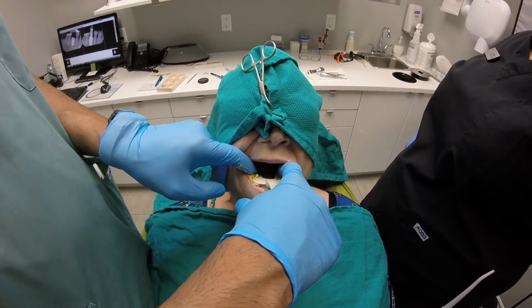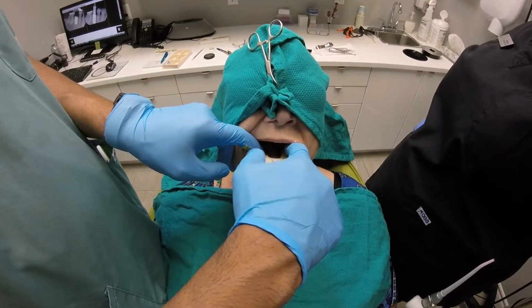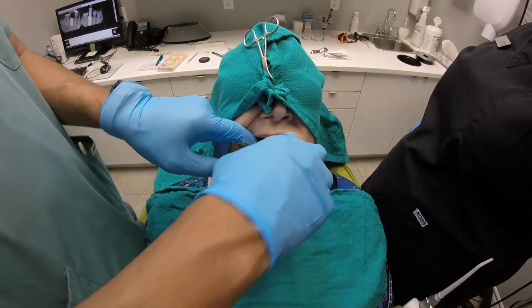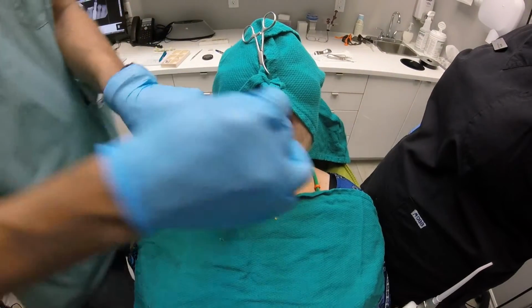This becomes the continual waiting game. So I'm just checking with my finger here. Make sure the patient's doing okay, doing a fancy turn. Grab my screwdriver. Ask the patient to open.